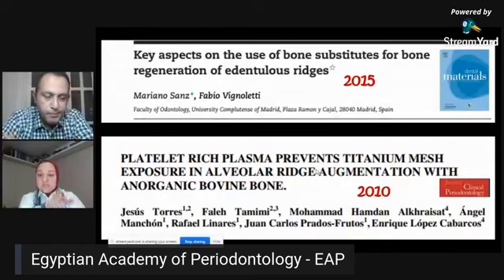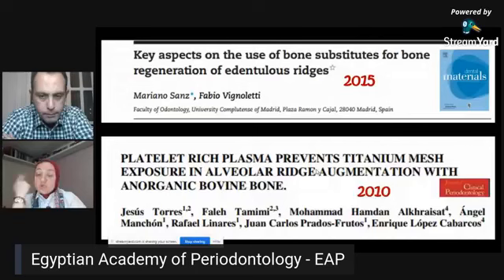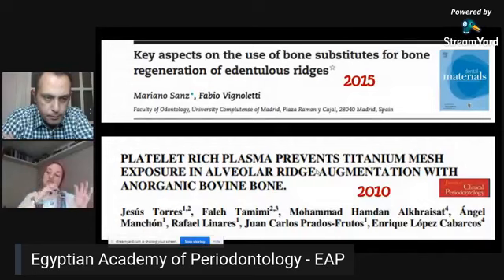But in our randomized clinical trial, we used just the xenograft to avoid the morbidity of a second surgical site. What I would recommend right now, and I would prefer to do, is using an auto-chip maker. There's this small burr called auto-chip maker. It goes with a low speed, and then you can drill much like the trephine burr, but it comes out with the bone already crushed.